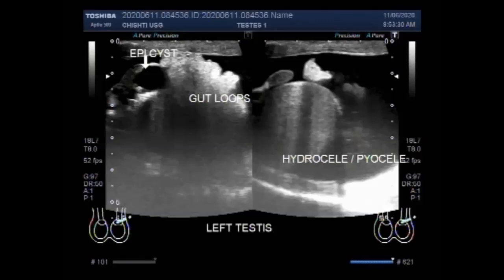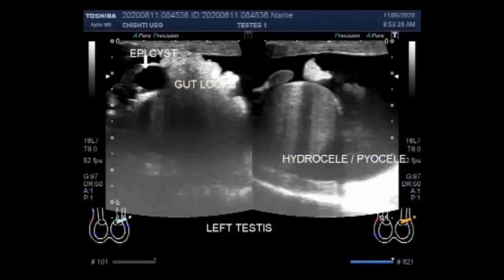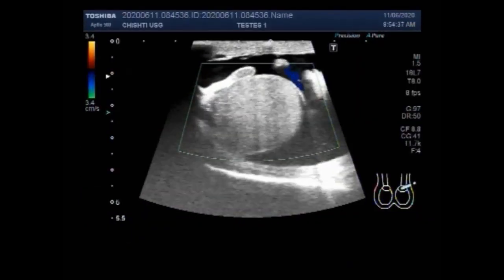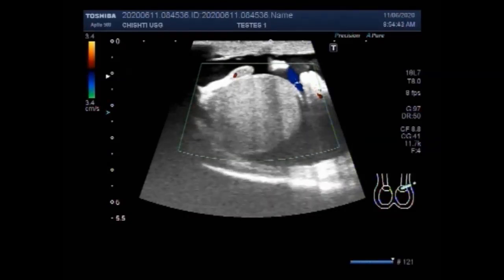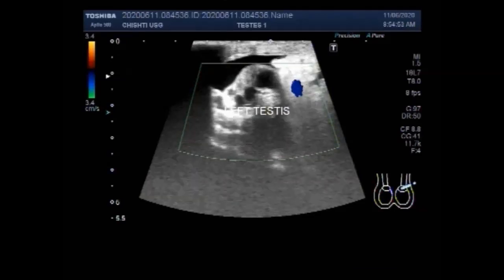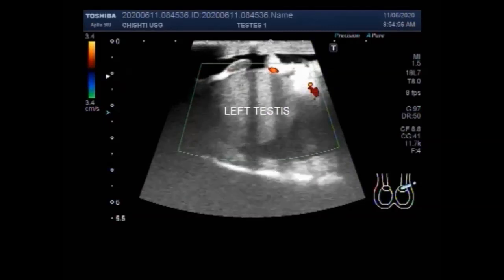Now you can see the epididymal cysts, the gut loops forming the inguinal hernia, and the hydrocele piocele around the left testicle. The blood flow of the left testicle was decreased. You can see the blood flow outside the epididymal cyst and the left testicle has minimal blood flow. You can also see the epididymal cyst.